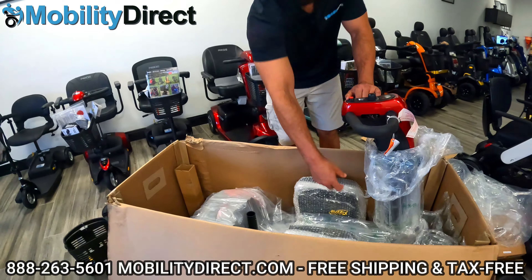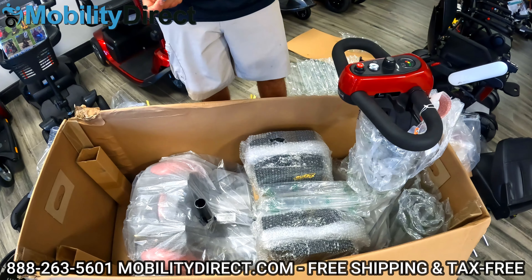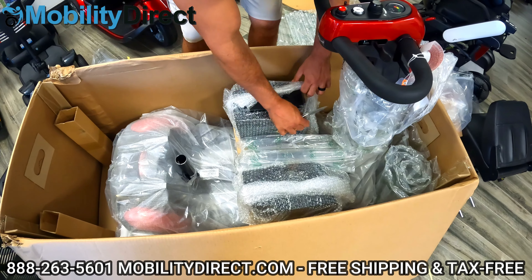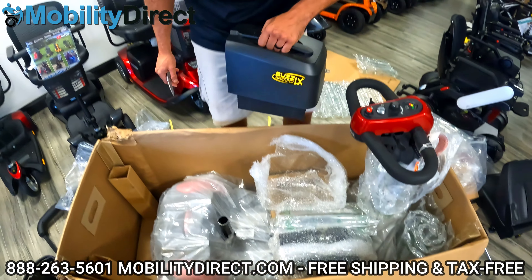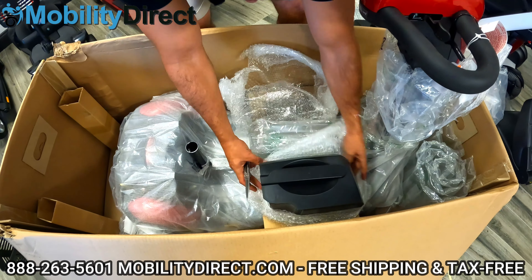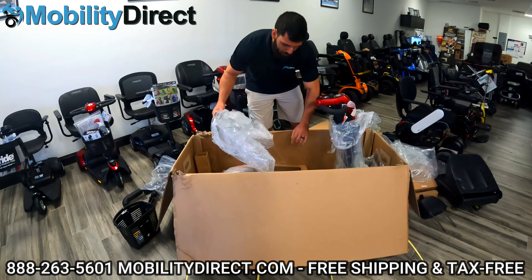You don't have to bend down and unscrew a knob like some other models. At this point, the battery boxes are here — it comes with two battery boxes. It's the same setup as the Buzzaround Extreme. You've got two 12-volt batteries, one in each box, and each has a convenient handle. I'm going to put one to the side and carefully cut the tape so I can access the handle on both of them. That's the other battery box — I'll put that to the side as well.